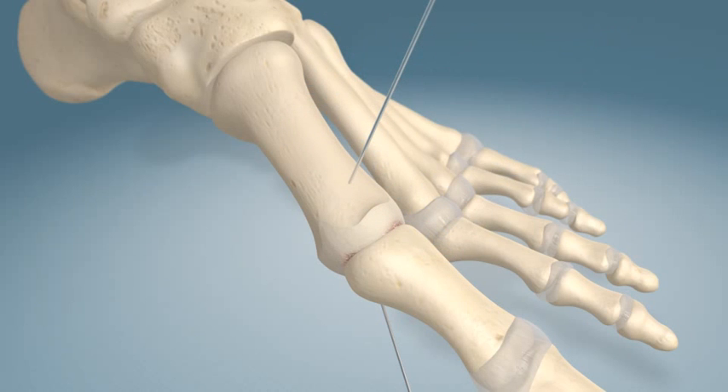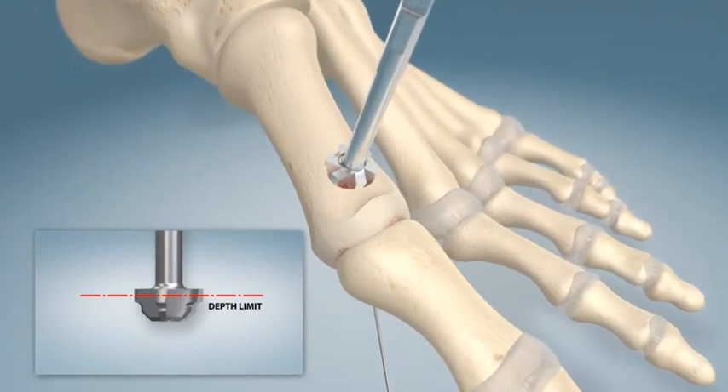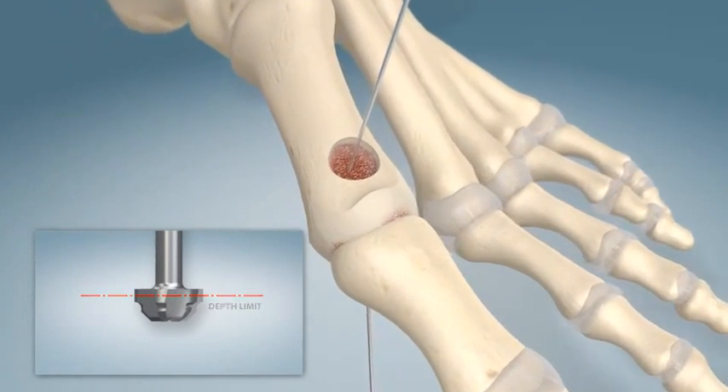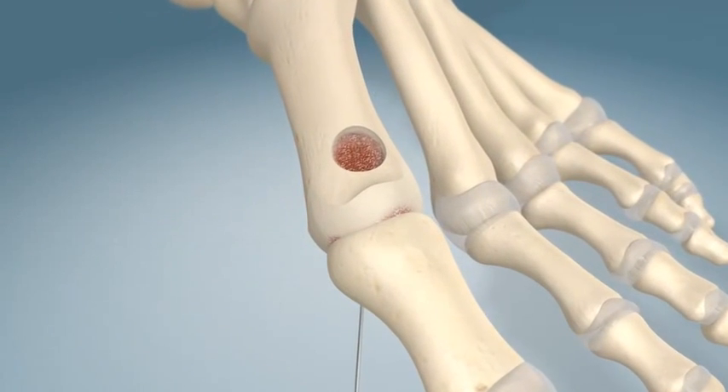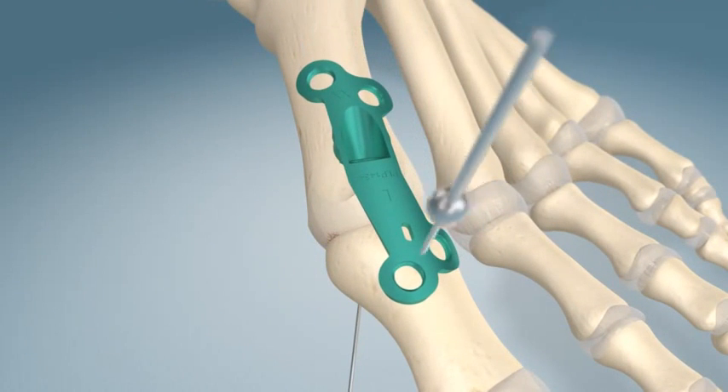Once positioned, the template is removed and the CP reamer is placed over the guide wire and advanced until the appropriate depth limit is achieved. After reaming is complete, the guide wire is removed and the plate is positioned using temporary fixation.